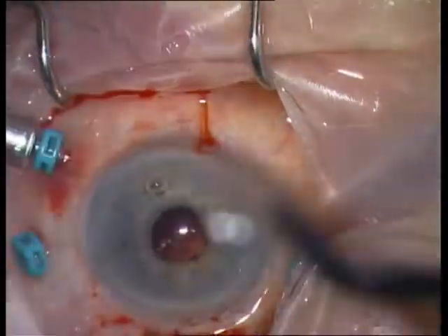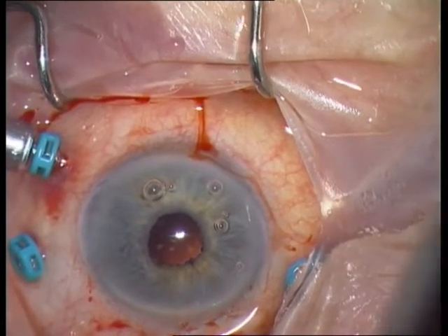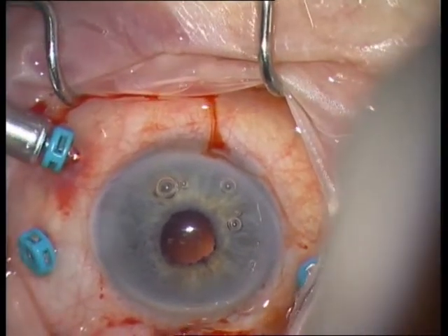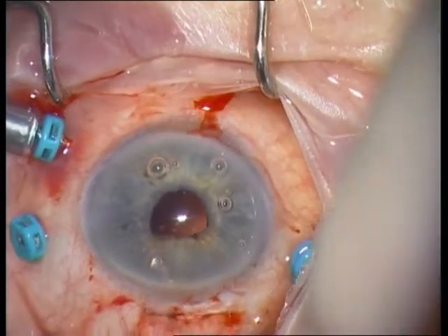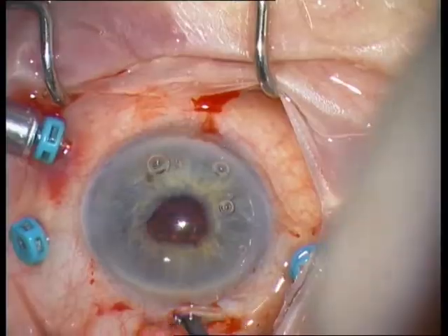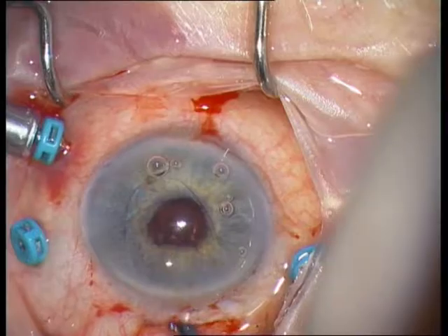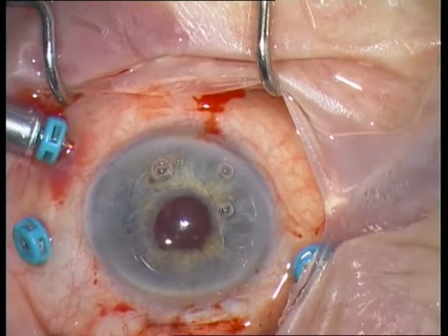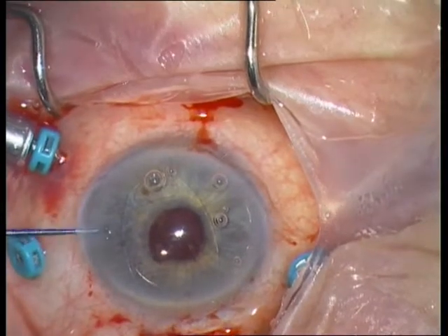Now comes the iris claw IOL — it has to be upside down. It fits nicely into the incision. 6 mm is perfect. The next step is the proper centration of the IOL.